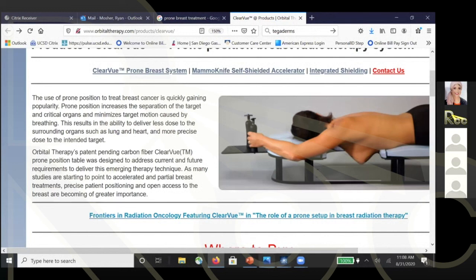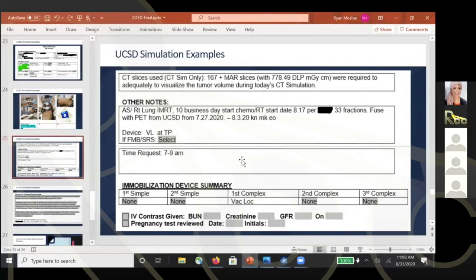Okay, let me translate it. Your question about the pendulous breast or huge breast: they do taping, meaning they stick the breast with plaster, pull it and keep it in the same position every day, but they don't use a mask, they don't make a breast mask. For me, I make a breast mask, in Egypt we do breast mask, but we know it will carry some acute reaction on the skin sometimes. In Ryan's center they use taping, plaster, to fix the breast in the same position. Okay.